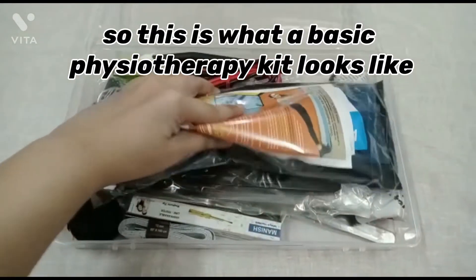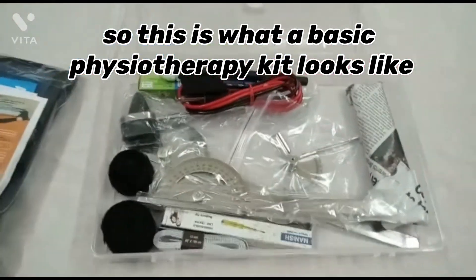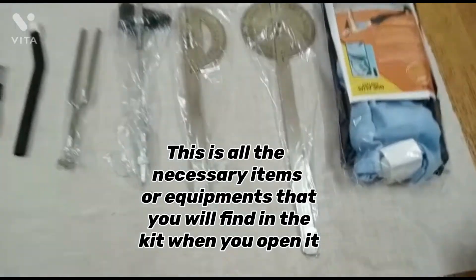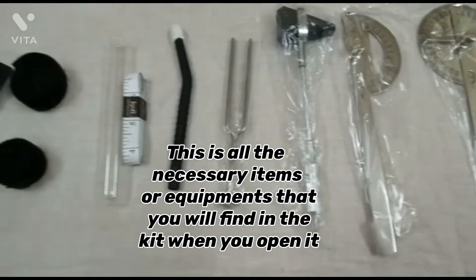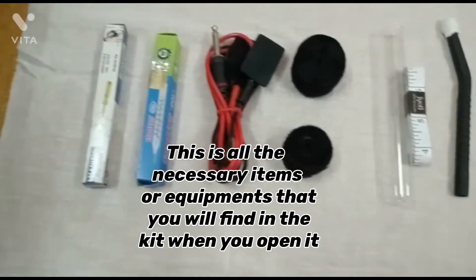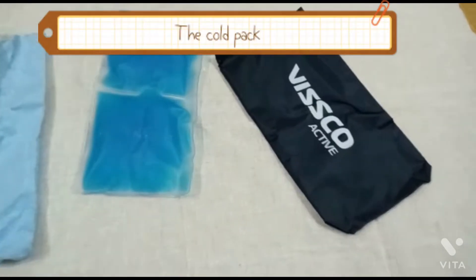So this is what a basic physiotherapy kit looks like. These are all the necessary items or equipment that you will find in the kit. When you open it, the first item is the cold pack.